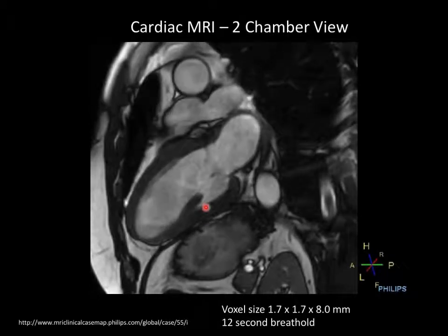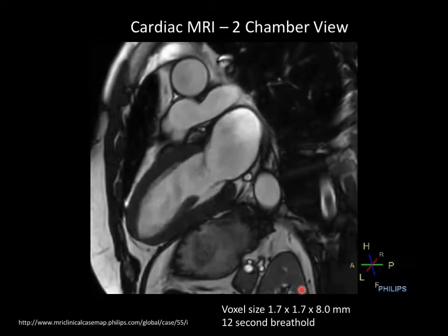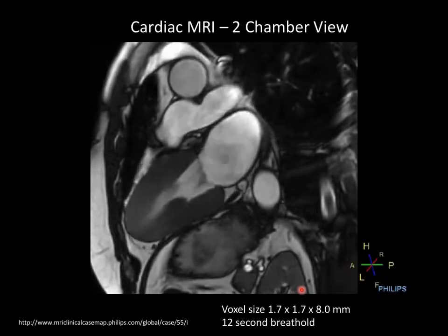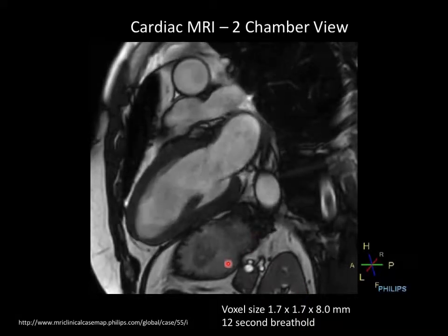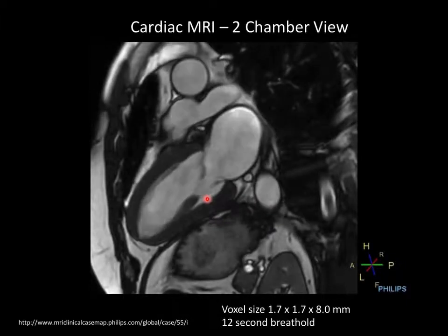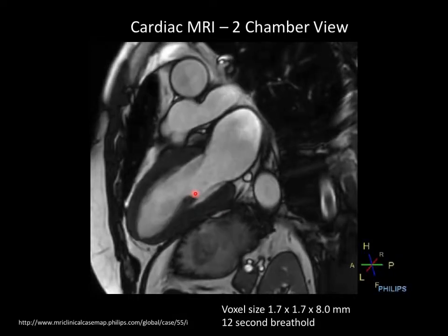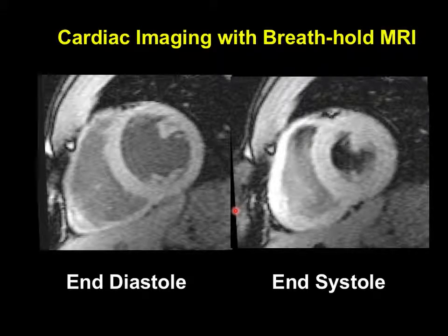The other interesting thing about cardiac motion is you can see that it is broadcast to other organs in the body, right? So when the heart contracts, it sends a vibration, like a long shockwave down through the body, which you can measure like displacement with this as your stimulus, right? So if you wanted to measure whether something's stiff in the body, you could use this as the stimulus for pushing on stuff inside the cavity. I don't know that anyone's done that either, actually. So that would be a cool project.